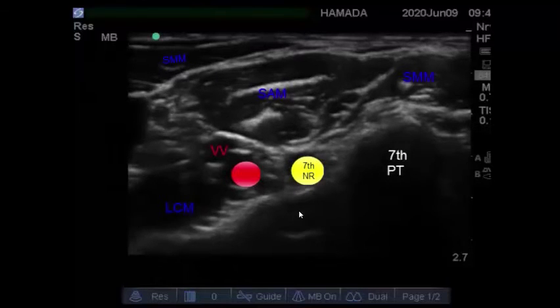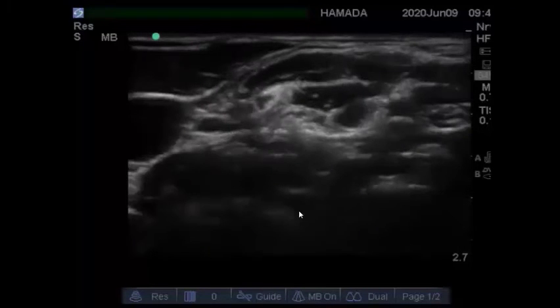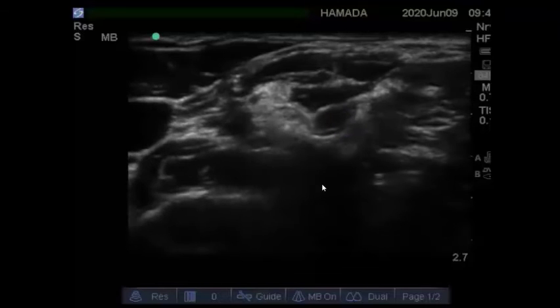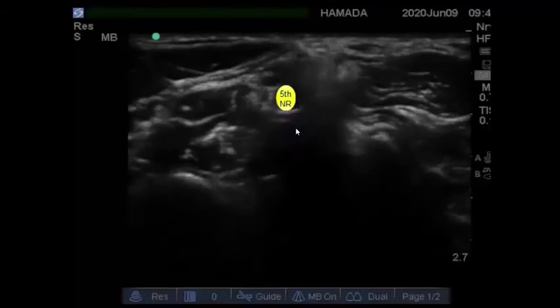Now start to move the probe, sliding it up to reach the sixth cervical level. Here we can see the posterior tubercle and a prominent anterior tubercle — this is the sixth nerve root. Sliding the probe up again, this is the fifth nerve root, and this is the anterior tubercle and this is the posterior tubercle.